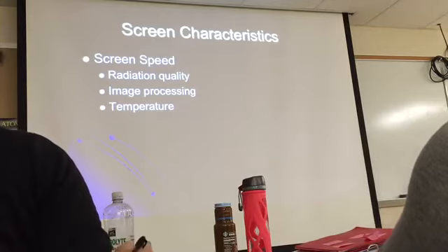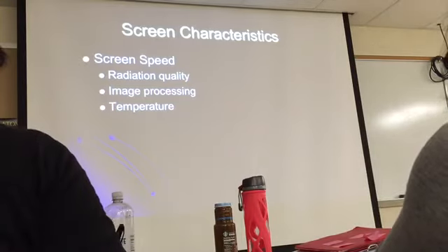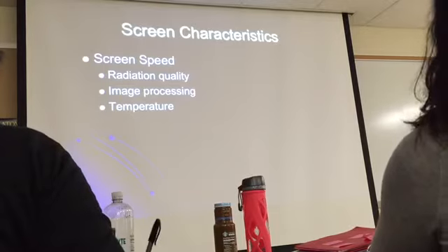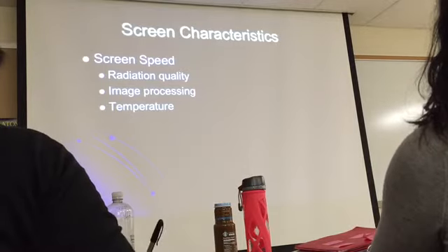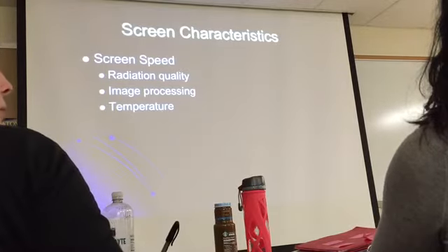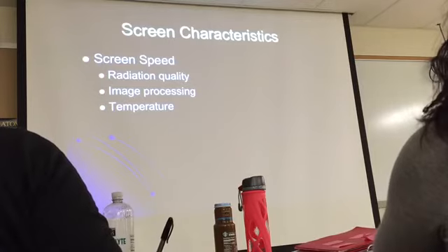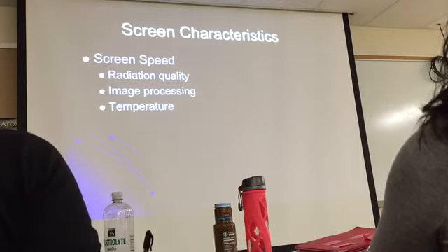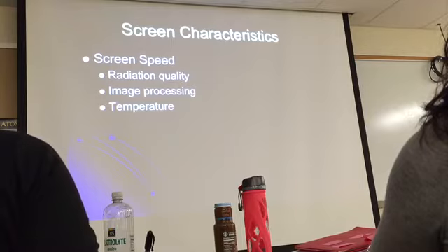For example, if you look at this, these screens, you will put the same type of film inside both of them. The screens are different. See, this is a screen that has the dotted borders. That's the extremity screen.